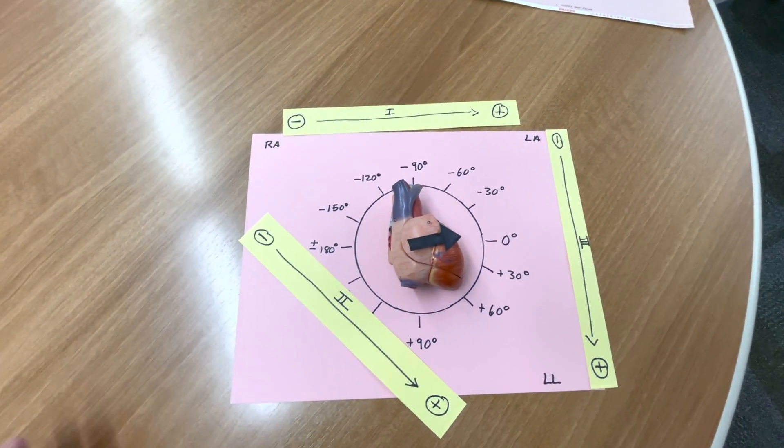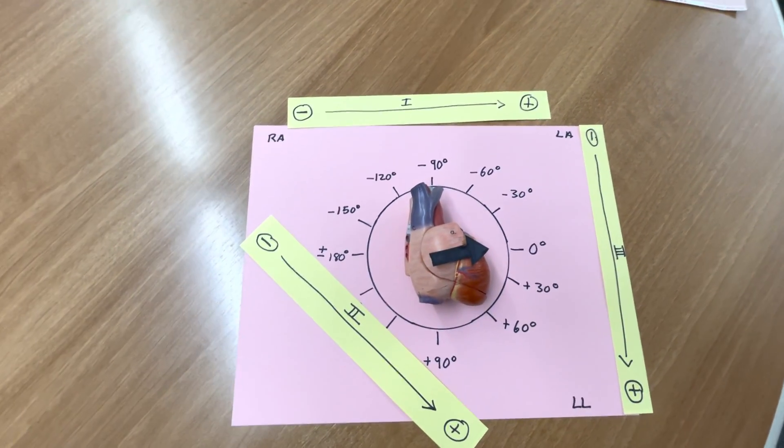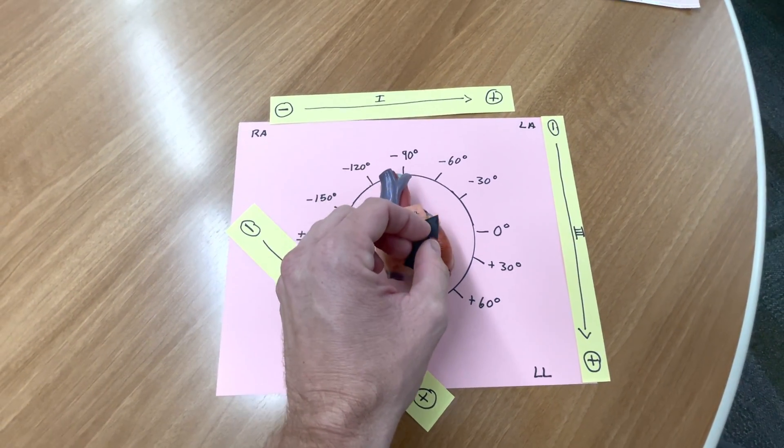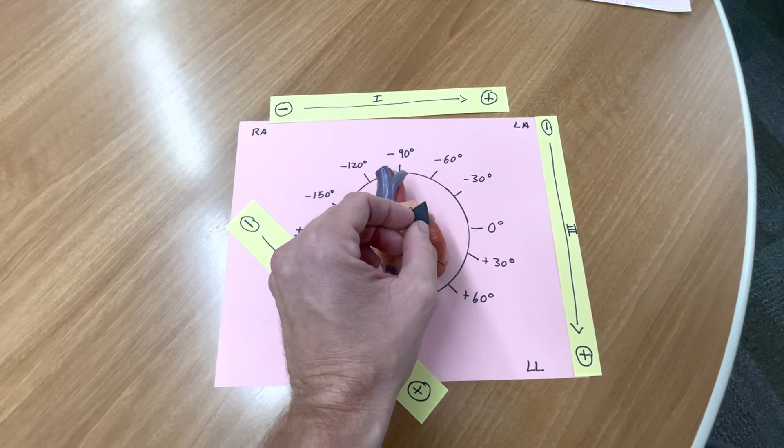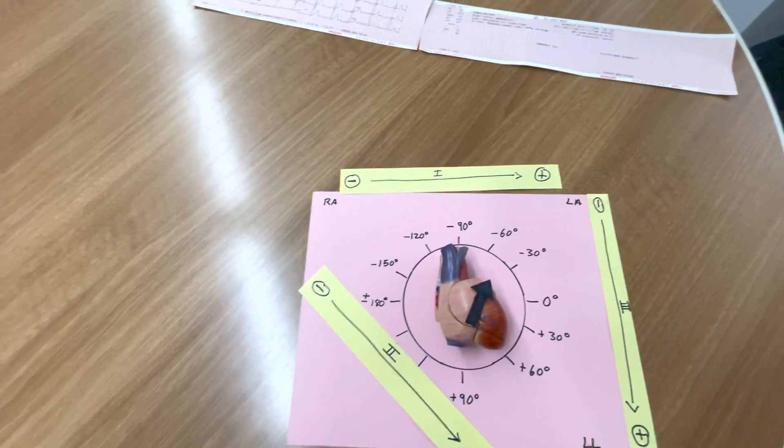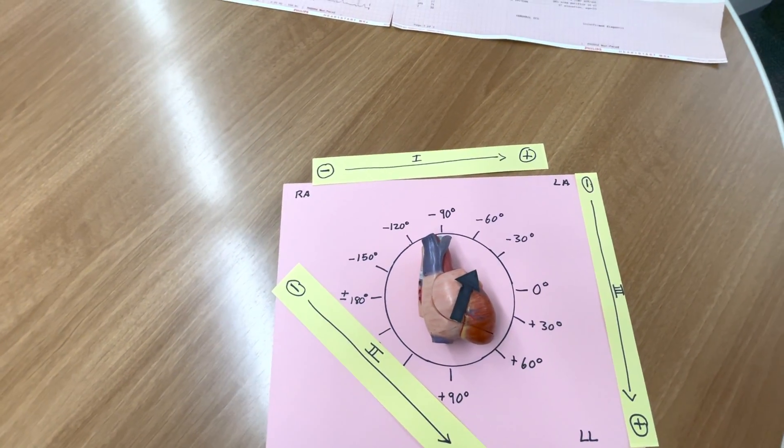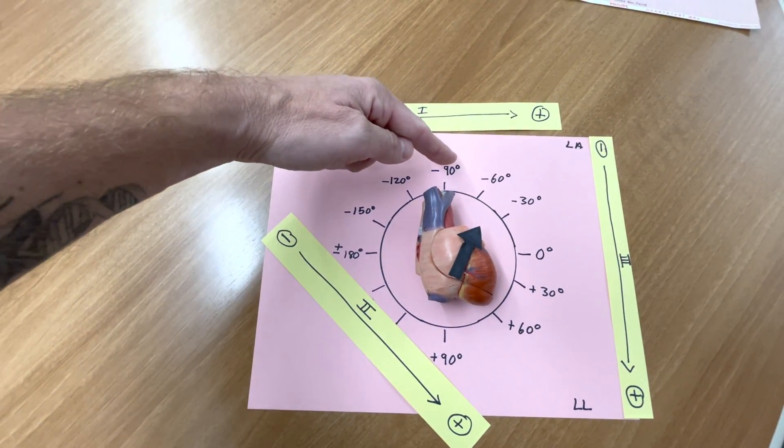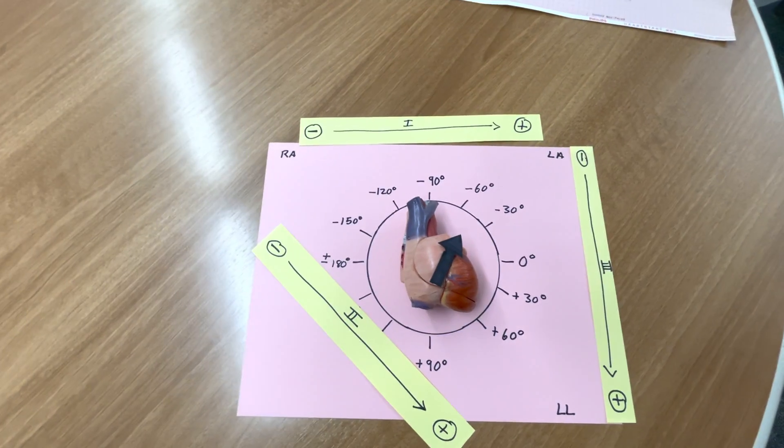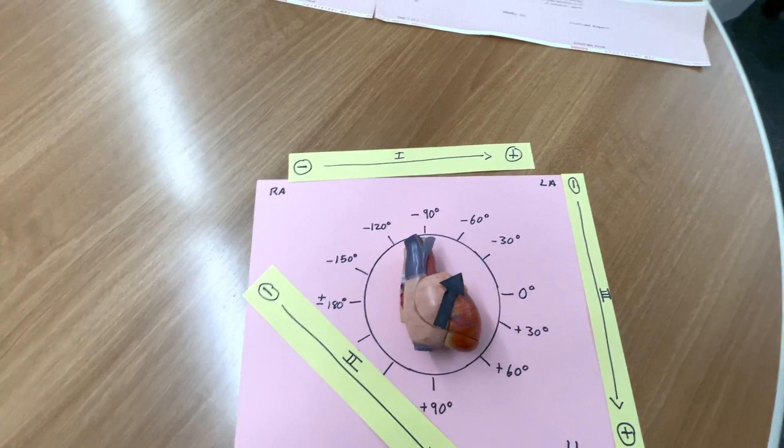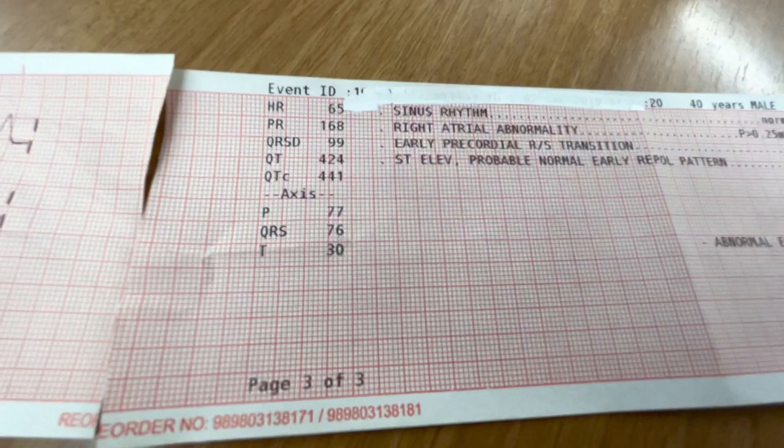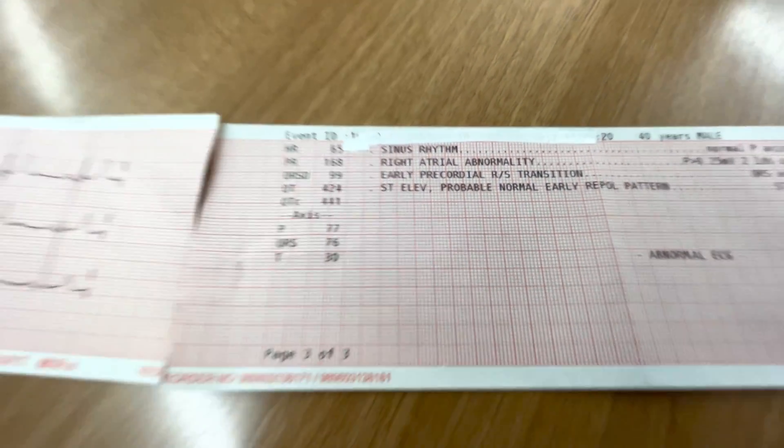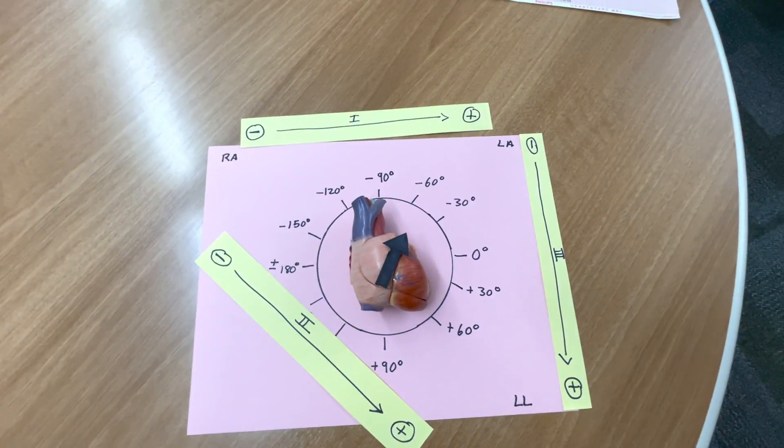From negative 30 to plus 90 is generally considered normal. 0 to negative 30 is physiological left axis deviation. Now, when that goes above and you have something that looks like this from negative 30 to negative 90 degrees here, that is what we call pathological left axis deviation. So, you go to your 12 lead, you look, and if that QRS or that Q axis is between negative 30 and negative 90 degrees, that patient has pathological left axis deviation.